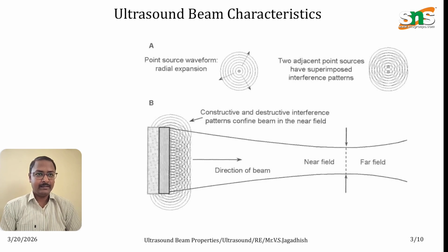Next to picture A, towards the right side, there are 2 points. Picture A represents when one stone is dropped in the water and how the concentric circles are formed. The second picture explains when 2 stones are dropped simultaneously in still water, how the concentric rings are formed. Like that, when you increase the number of stones dropped in the still water, many concentric circles will form, and we see where they meet together to form strong waves.